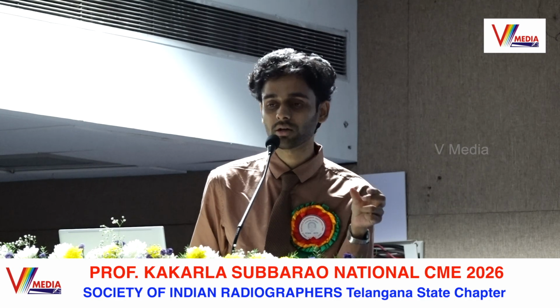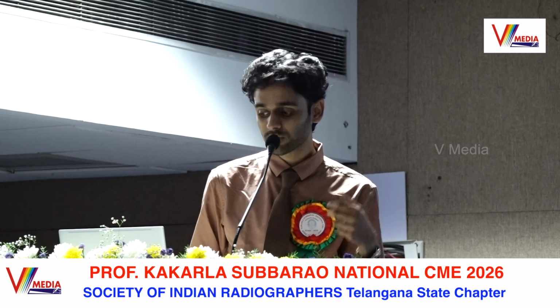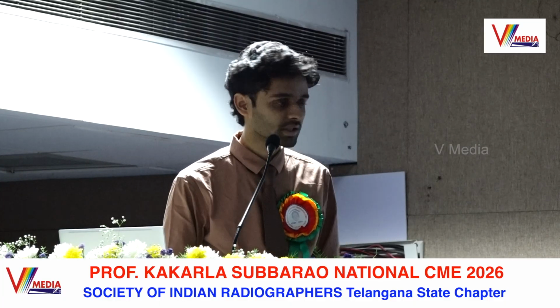So for that we need to know where the corticospinal tract pathways are. At the same time, we need to know which region has which cortex. Is it a speech cortex or is it a motor cortex? That's what primarily we need to be aware of. So for that we will be needing two things, DTI and a functional MRI, and an anatomical base. When these three things are fused together, then we will get a proper idea for a surgical approach.